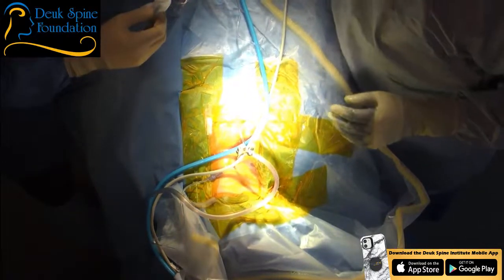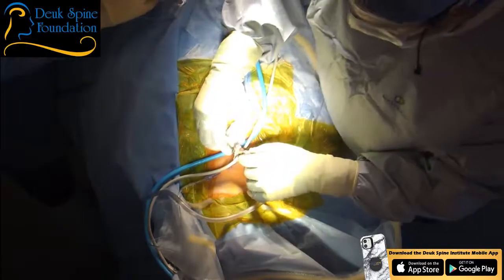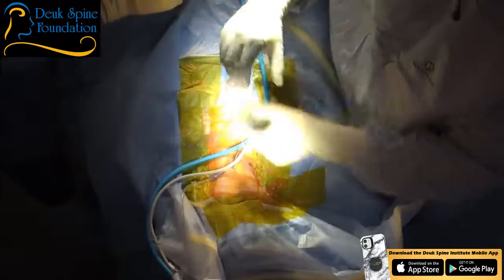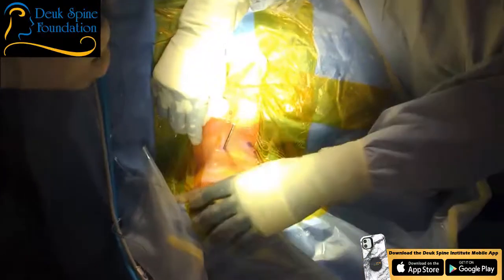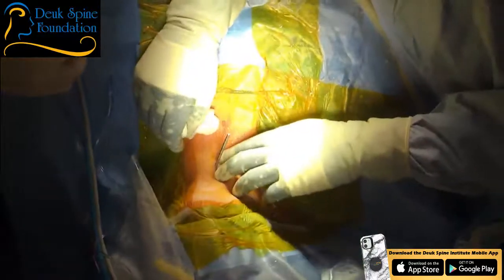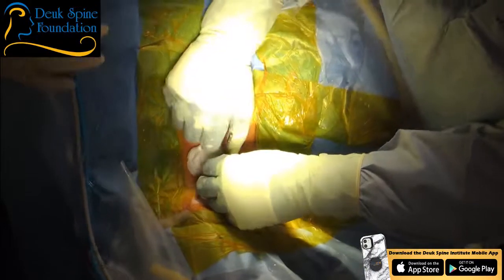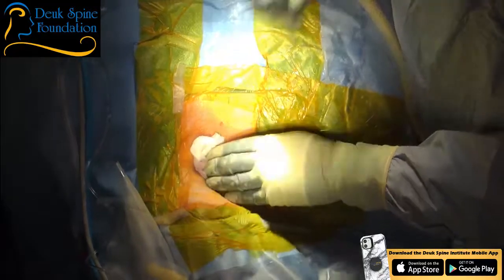Watch out for your scalpel. All right, let me show you this here so y'all get a good idea of what's been done. So this is her neck, this is her chin, okay? And this is the tube that the whole surgery was done through. This little tube right here.